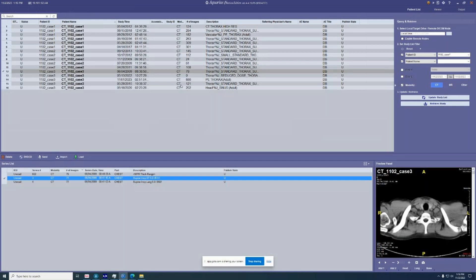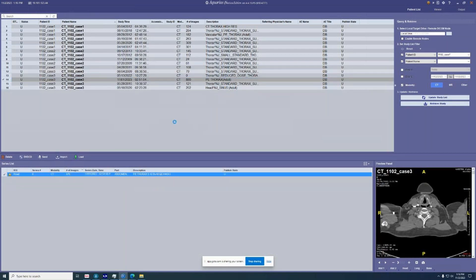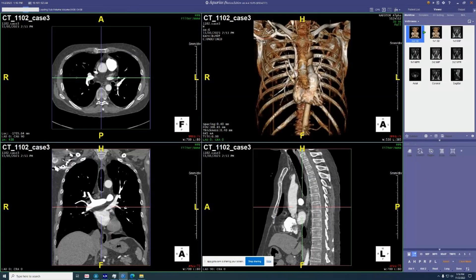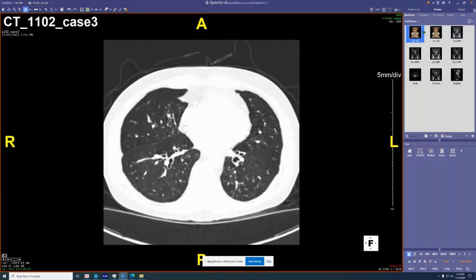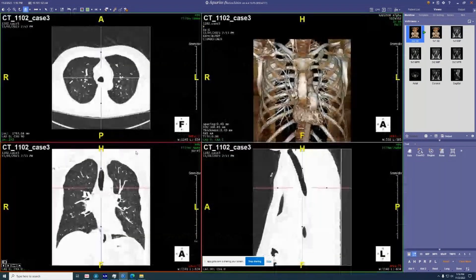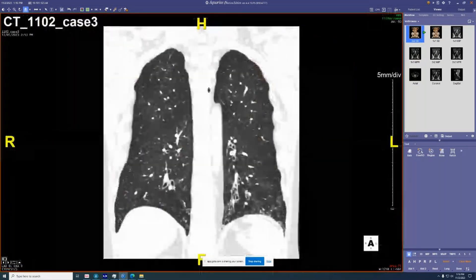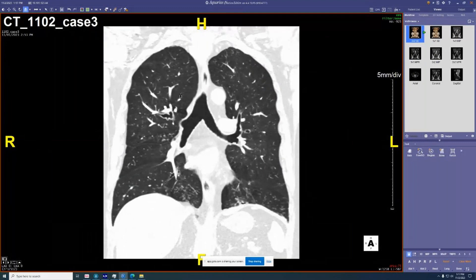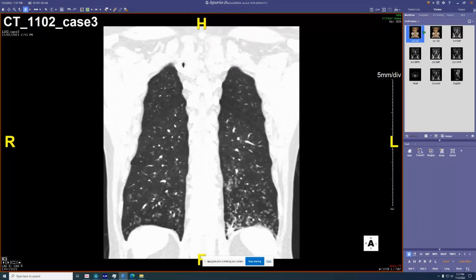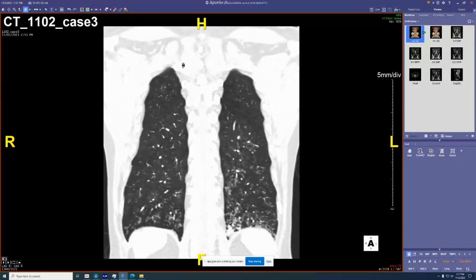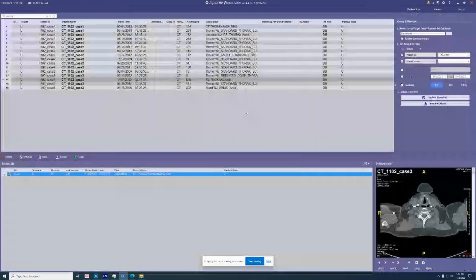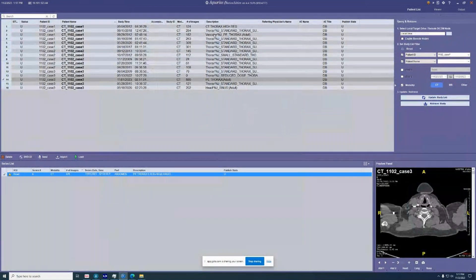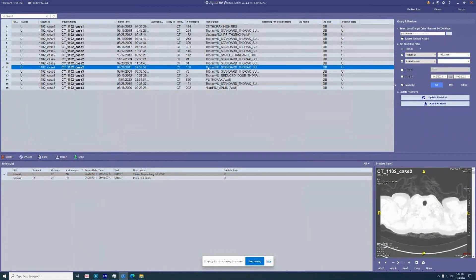This is a biopsy-proven pan bronchiolitis case. The patient didn't have any ciliary dyskinesia; she was a young woman of Asian descent. We see a fair number of these here. Even though it's called pan bronchiolitis, it really isn't completely diffuse as the name implies, but pathologically it is distinguishable from other causes of bronchiolitis.